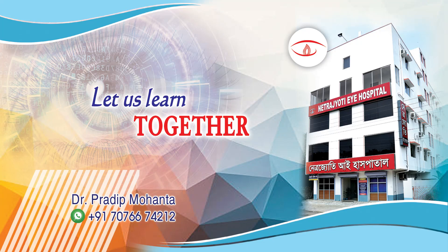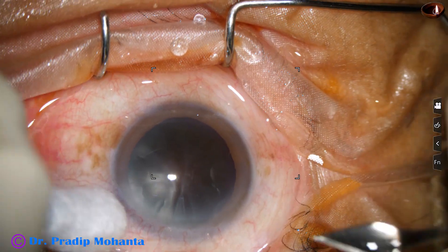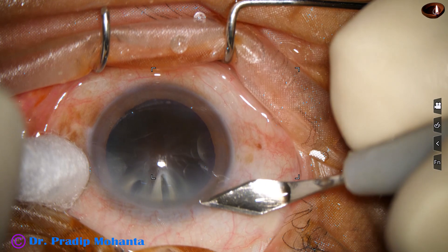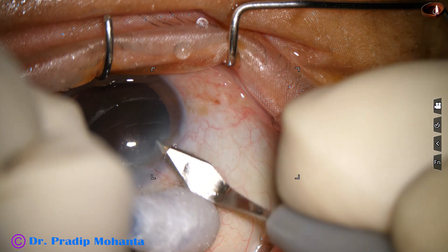Friends, welcome to my workplace at Ranaghat, West Bengal, India. This is a very hard cataract — one of the hardest cataracts I have ever operated. Let us observe this surgery.